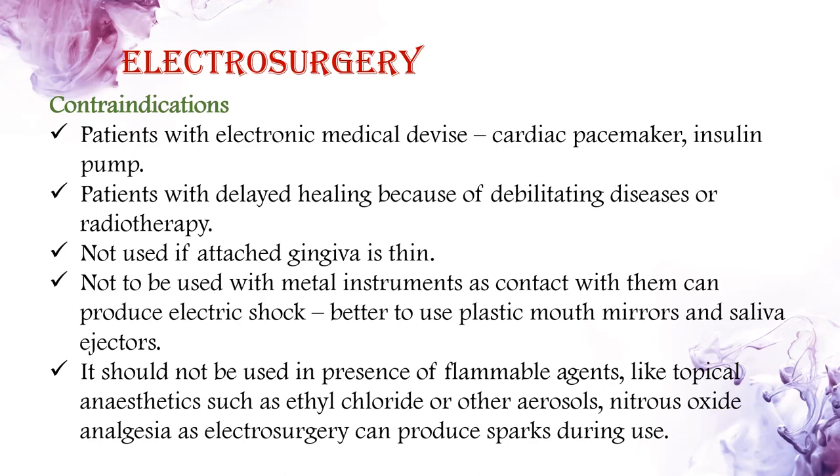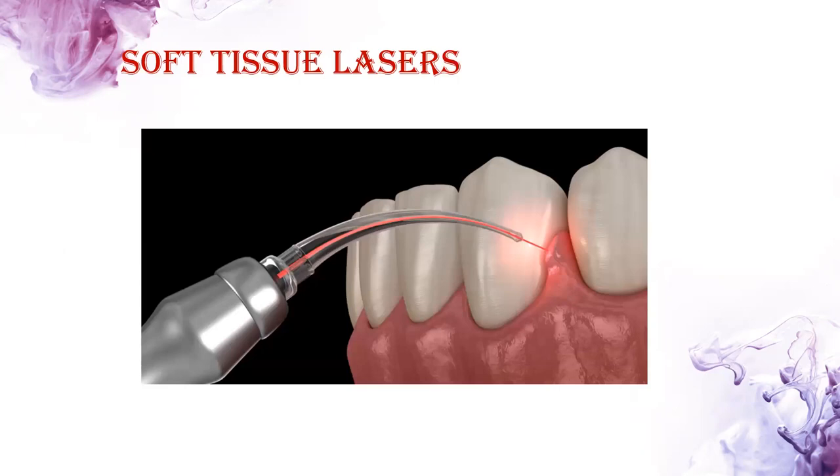It should not be used in the presence of flammable agents like local anesthetics such as ethyl chloride or other aerosols, nitrous oxide analgesia, as electrosurgery can produce sparks during use. Soft tissue lasers. These are also used for gingival retraction similar to electrosurgery.